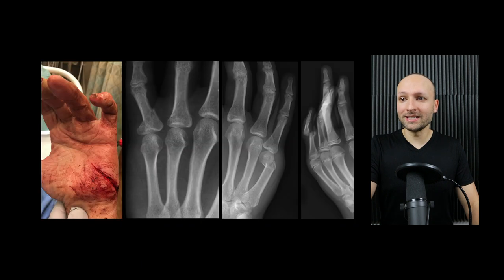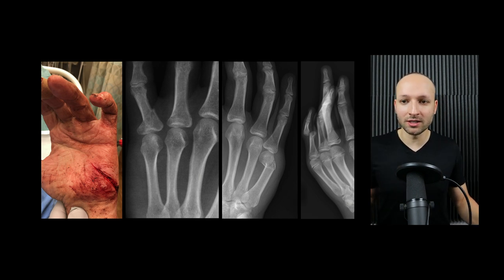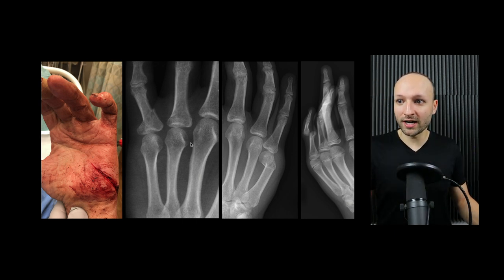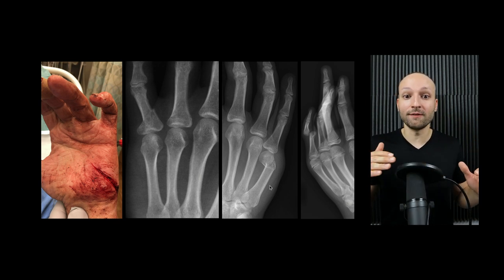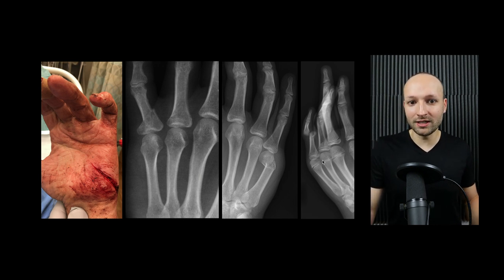As far as indications, it covers basically anything on the ulnar aspect of the hand — deep and superficial. On the left side of the screen, we have a laceration sewn up nicely with an ulnar nerve block using just 5 cc's in the mid forearm. In the middle, a phalanx fracture. And most commonly — a boxer's fracture, the fourth or fifth metacarpal fracture. If you need to reduce those, the ulnar block works great. We also have a pinky dislocation — all cases where I've found the ulnar block very helpful.